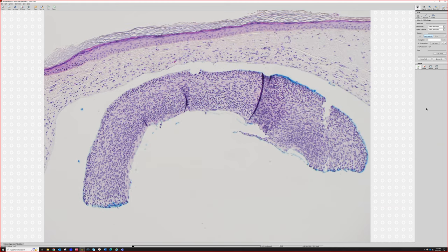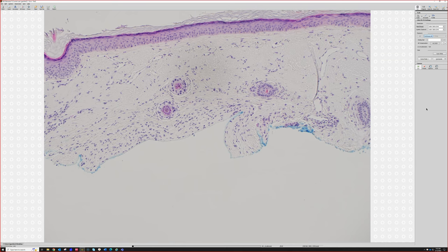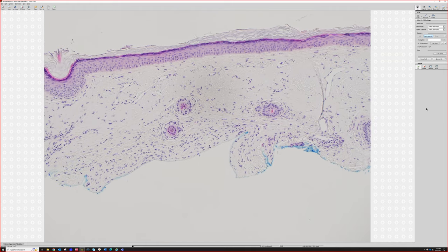So the reason that this is important to recognize is because, look, sometimes you get a biopsy like this, where there's nothing, but there's a little space that looks like a cyst, and then there's some of that stroma around it, and you don't see any tumor. So when I see that, first I look around on the other sections, maybe do a deeper, see, is there basal around here? But if you don't see the basal, I would still say this is suggestive of a basal cell that has become detached during processing and fallen out of the section. So even just this alone has such a distinct look that we know there must have been a basal cell there. And for treatment purposes, they should treat this like a basal cell.